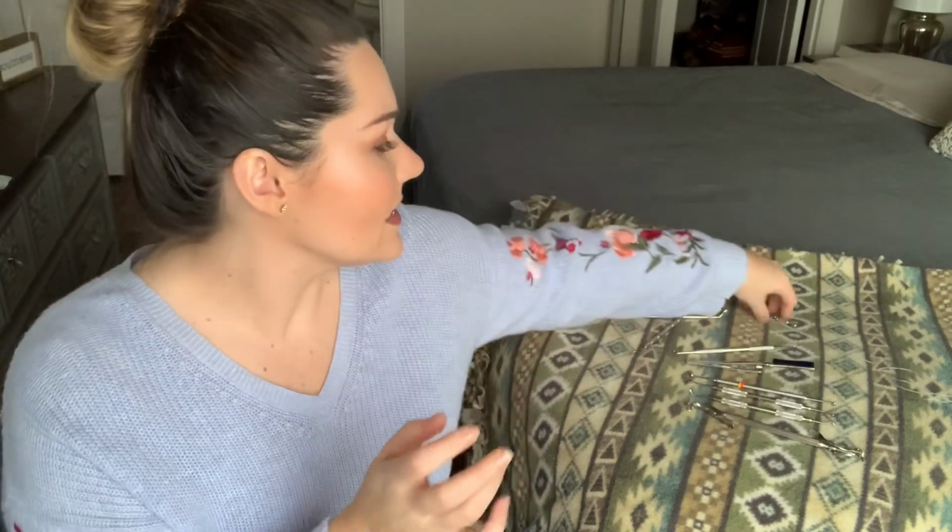So again, we already discussed what's gonna be on the dentist side, same exact thing. So of course you're gonna grab your suction, and he's gonna remove the decay from the tooth. Now the first thing he's going to do is he's gonna use this matrix here. This is used on every amalgam filling that is mesial or distal, that has a contact. If it's just an occlusal, you're not gonna need a matrix. But if there's not anything to pack the amalgam in, so if there's like a mesial or distal decay, you're going to need a matrix, so you can pack the amalgam in, if that makes sense.